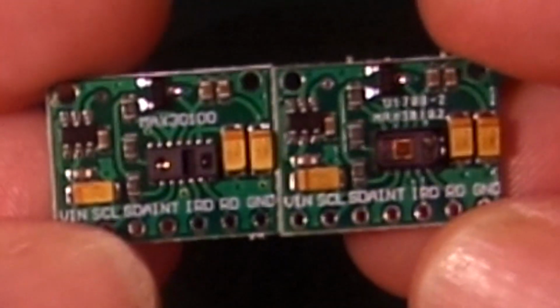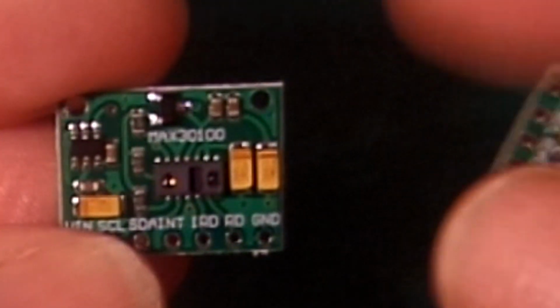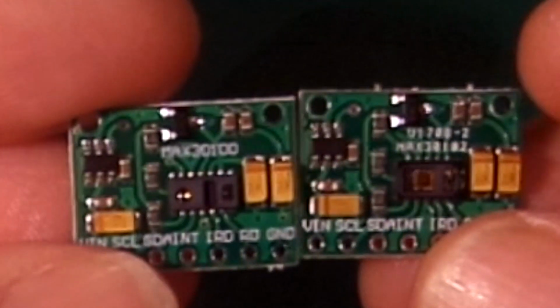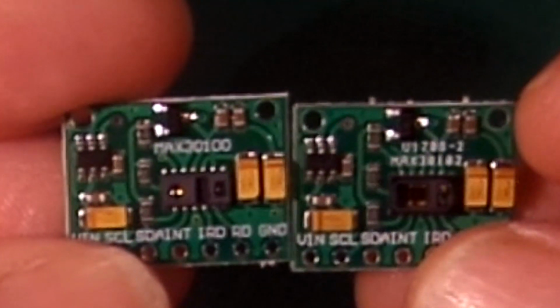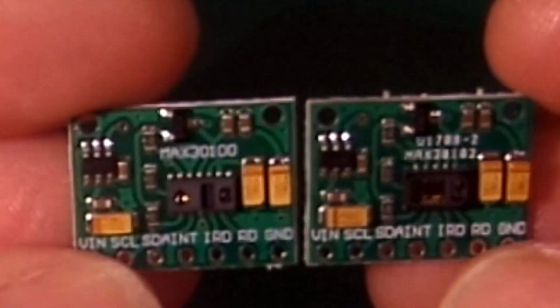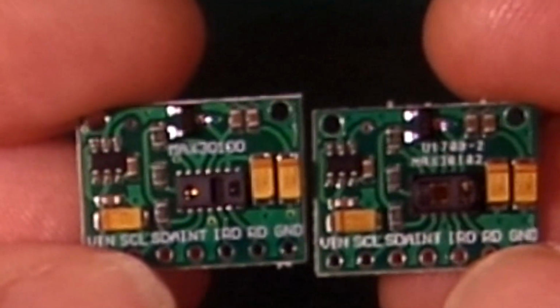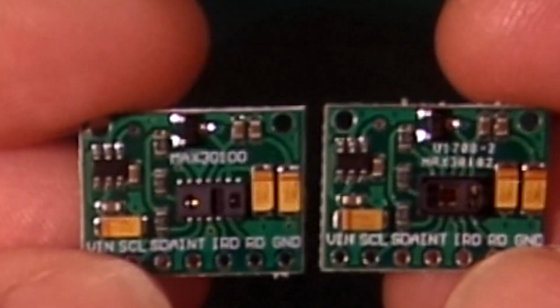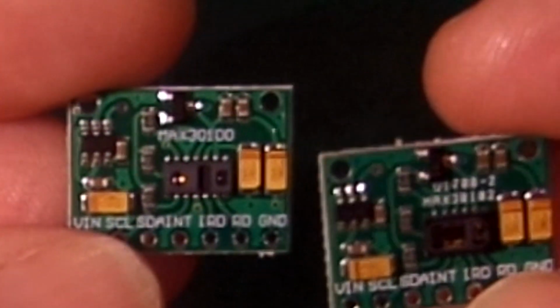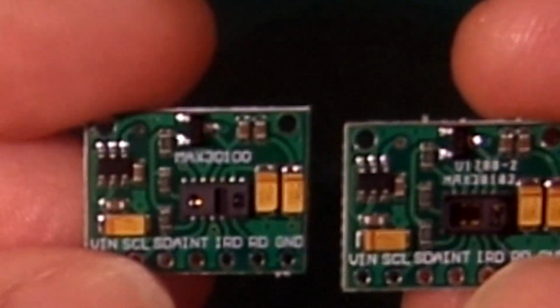Well, if you look at the actual text that's on them, one says it's a MAX30100, and if I turn that the right way up, sorry. And if you look at the text on this one, it says, very small, MAX30102. I had a look at the data sheets. The specs are virtually identical. There are some subtle differences in the specs, but nothing that would make a dramatic change to whatever project you were doing. The main difference I could see when going through the spec sheet was that the 30102 has a slightly bigger buffer for storing data. And it's a buffer you use to extract the information from these devices.